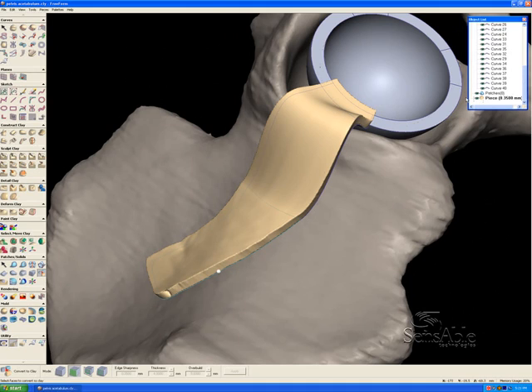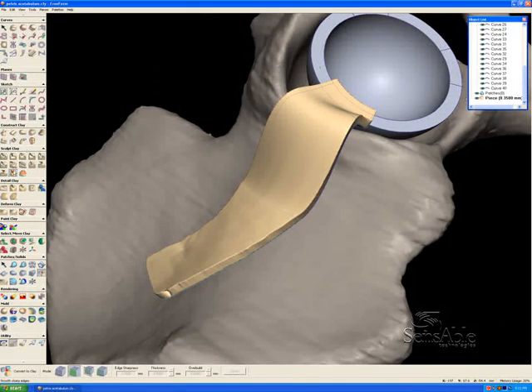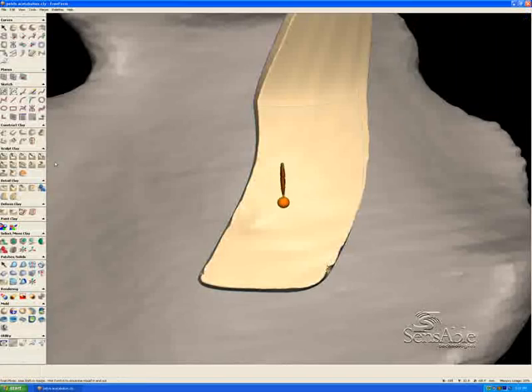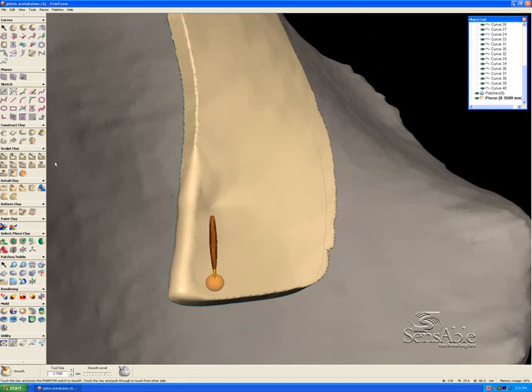If we wanted that surface data, we would just export it simply as an IGES surface before the thickening process as well. Here I'm going to smooth out these edges simply by touching them, and I have a smoothing tool right here. I'm just going to walk along the surface and smooth it out manually using the Phantom desktop device to touch the edges of this tab I've created. Anything that's implanted in the body, obviously we don't want any sharp edges on it, so we're going in and smoothing out the geometry so that it's as amorphic or organic in nature as possible.